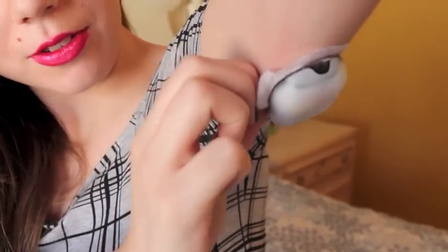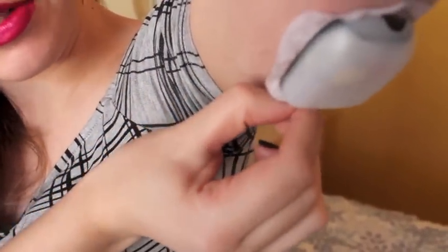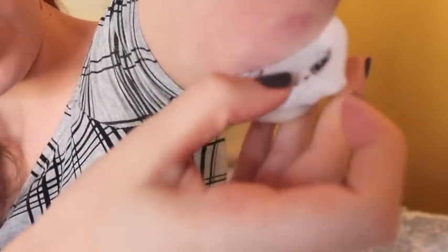So you just want to carefully pull at the edges because you don't want to pull any skin off, and it also hurts a lot when you do that. If you're squeamish, you might want to look away because that's the cannula that goes into your skin, and that part just came out. And there you have it. It's off.